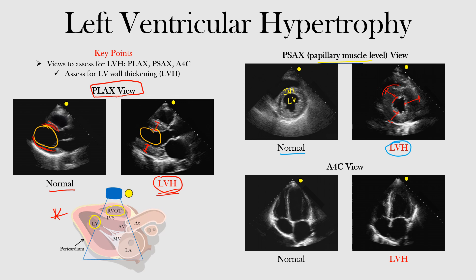In this last view, the apical four-chamber view — go back and listen to the lecture for how to find this view — we can see the left ventricle, the left atrium, the right atrium, and the right ventricle. We're going to focus on the LV. This is the normal left ventricle. And then notice the one that's showing LVH — the thickened left ventricular wall. Notice the difference in those.